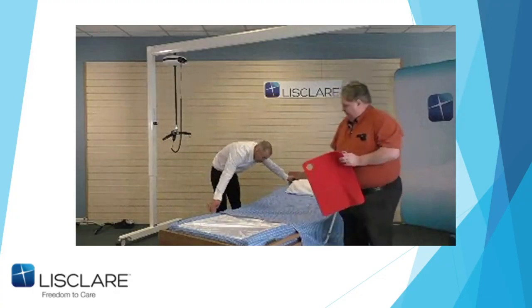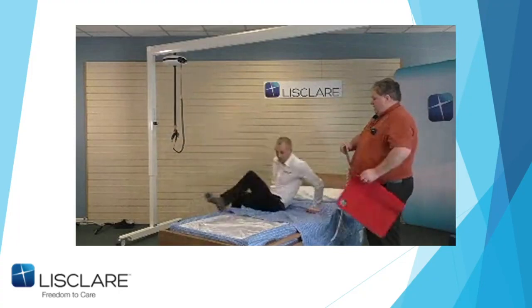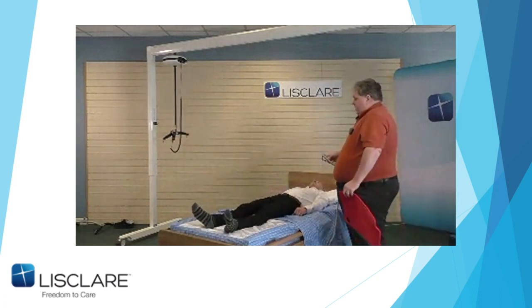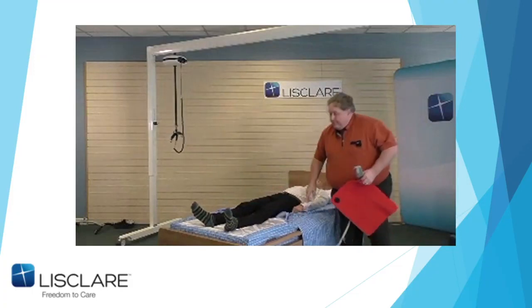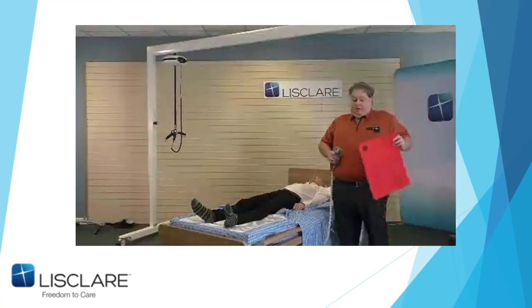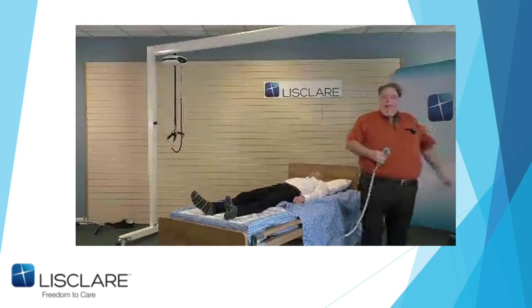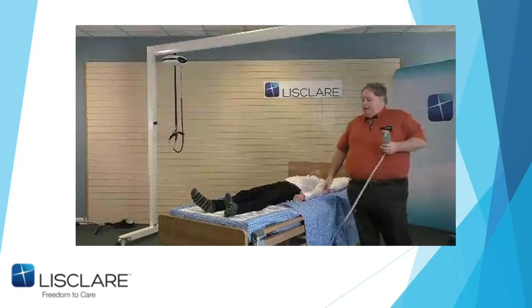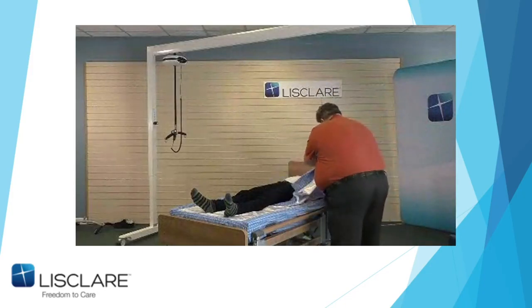Just to show you this, John gets to have a lie down again. Obviously, they're not getting onto it and then swivelling. That's a different way of doing that, which I'll not show today. If I've moved about, what you can't see is when I put my hand on there and start doing this, when I lift my hand, it's still flat underneath. Now, to get the sheets out, if there's two of you, you get diagonally either side, and pull. Diagonally either side, pull.